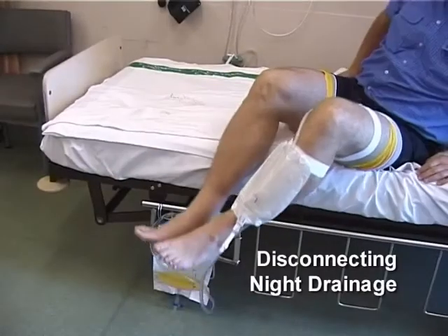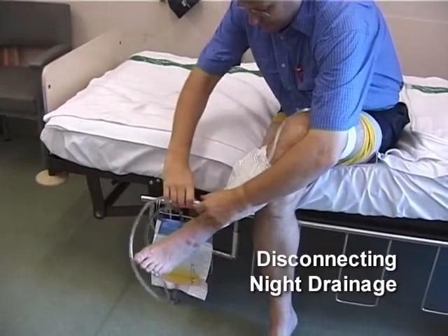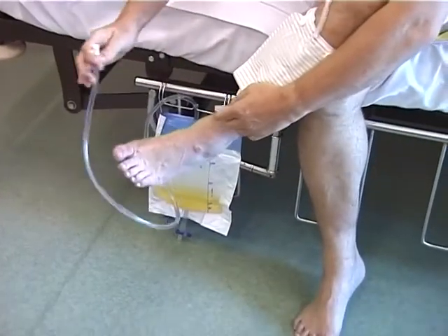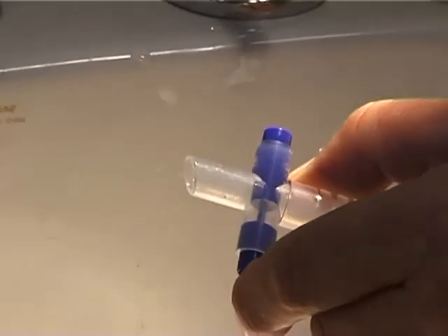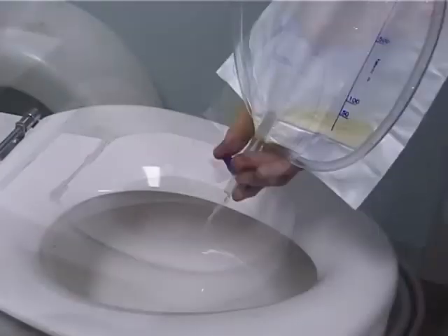Upon waking, ensure all the urine has drained from the leg bag to the night drainage bag. Clamp off the leg bag and disconnect the night drainage bag. Empty all the urine from overnight into the toilet before commencing the cleaning of the bag.